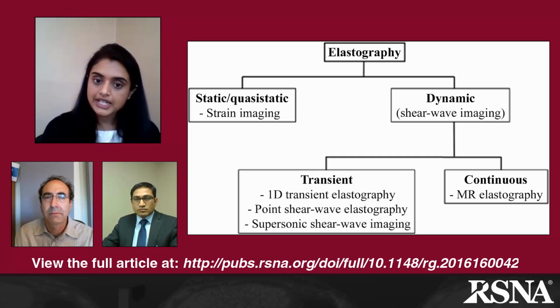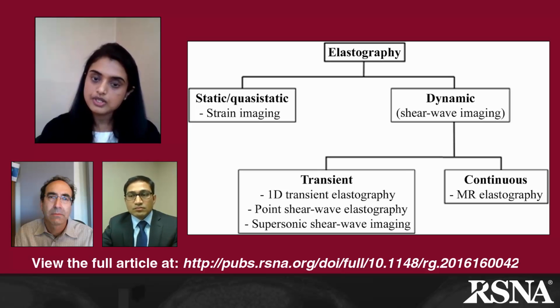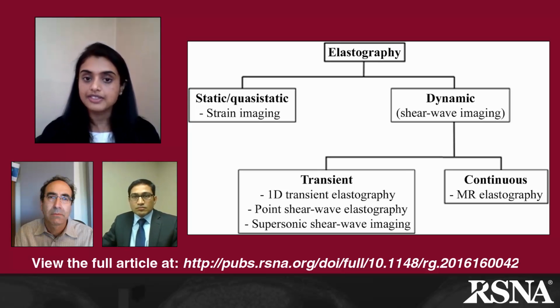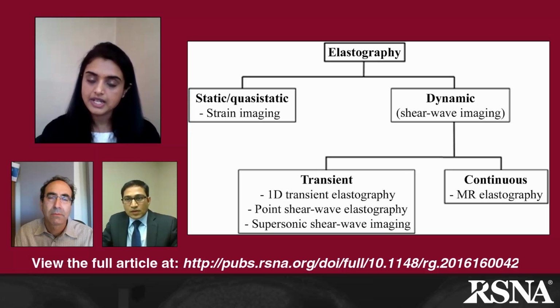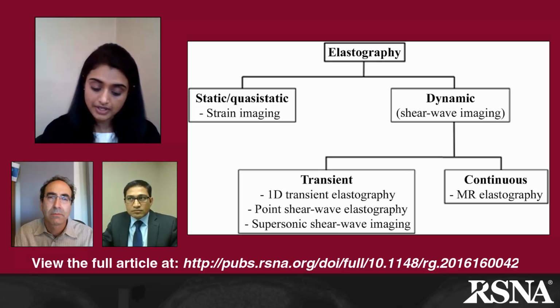Amongst the dynamic techniques, the common principle is production of shear waves within tissues. Either vibration or acoustic radiation force impulse is used to produce shear waves in the tissues, and the propagation of shear waves within the tissues is related to the elasticity of the tissues. So the less elastic or more fibrotic a tissue is, the faster it propagates these shear waves. Measurement of this velocity within the tissue can help grade the degree of fibrosis within these tissues.